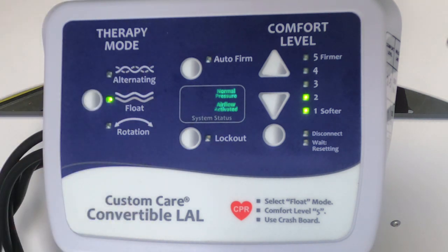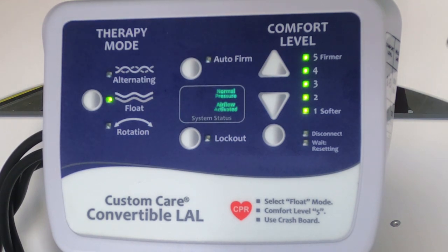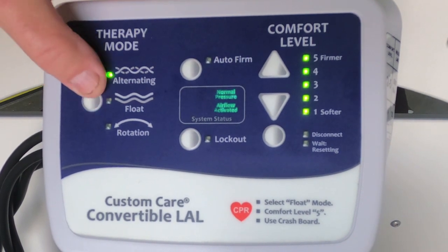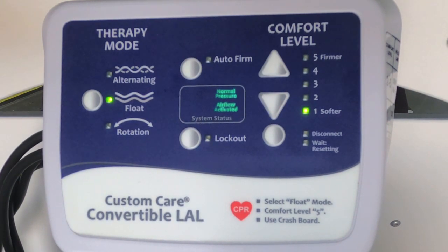The CPR instructions are, as you can see, printed on the controller, and they're pretty self-explanatory. You set the system on float. Okay. Take your comfort level setting all the way up to 5 and get the patient on a crash board. I'm going to take that back down. As far as transporting this system, you unplug it from the wall, you can transport it. It will maintain air support of the patient until you get back to wherever you're returning to and plug the system back in. A seated transfer, I would use the auto firm if you're going to do a seated transfer for the patient.